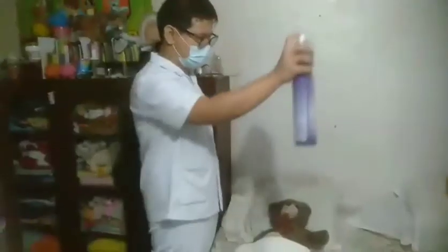Then remove the gloves and restore or discard all equipment appropriately. Wash your hands. Air freshener is also applied. And for your evaluation, make sure to evaluate the client's tolerance and reaction to the procedure. And then regularly you have to assess and ensure that the peristomal skin integrity remains intact. And the client or the caregiver is also able to demonstrate performing irrigation of the colostomy. Client will express positive feelings about self, and client maintains fluid balance.